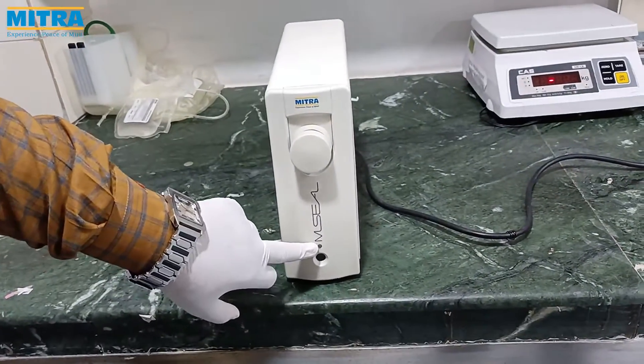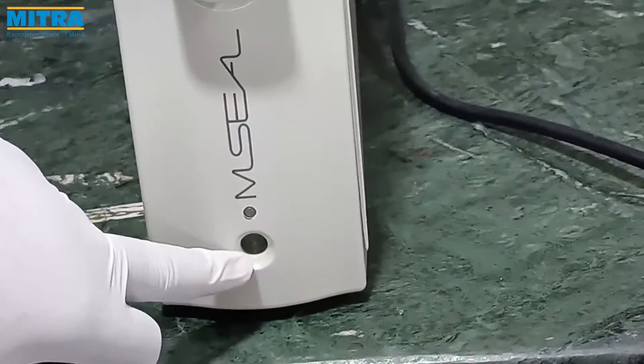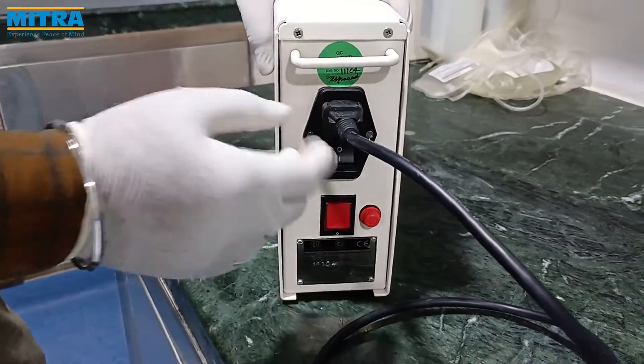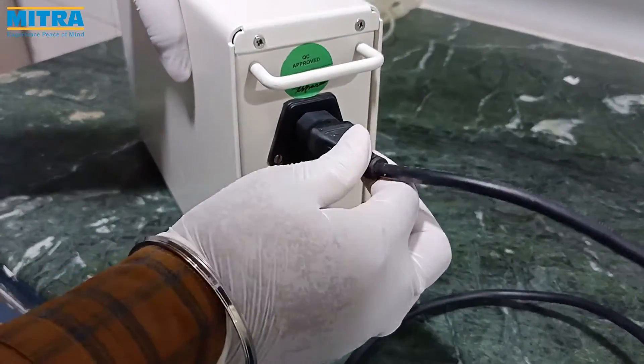This is the LED indicator light which shows system ready, sealing, and battery status. This is the power cord which is used to charge the battery and can also be used to run the device on direct current.